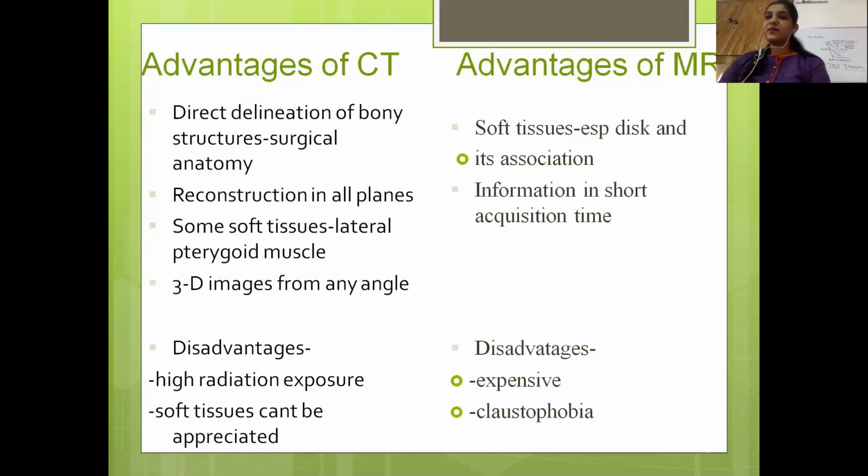Then the disadvantages: it is expensive, and some patients are very claustrophobic. They don't want to go into the gantry, and with all the sound coming from the magnetic resonance imaging, they don't want to go. So they are claustrophobic, and that's one of the disadvantages of MRI.